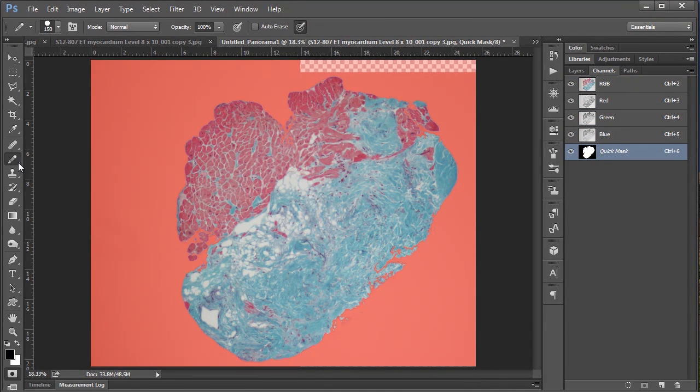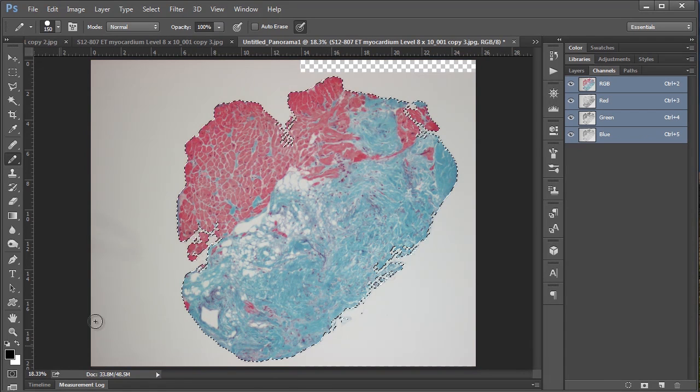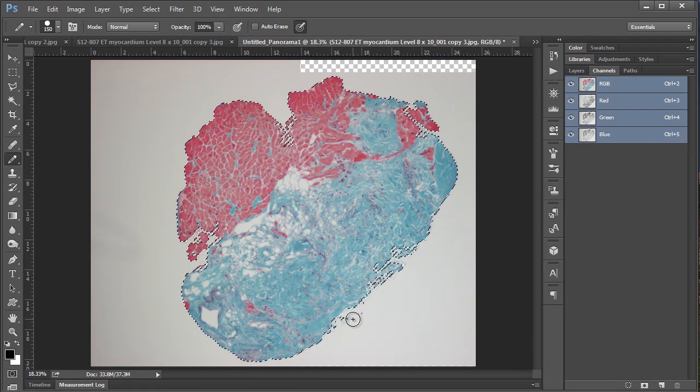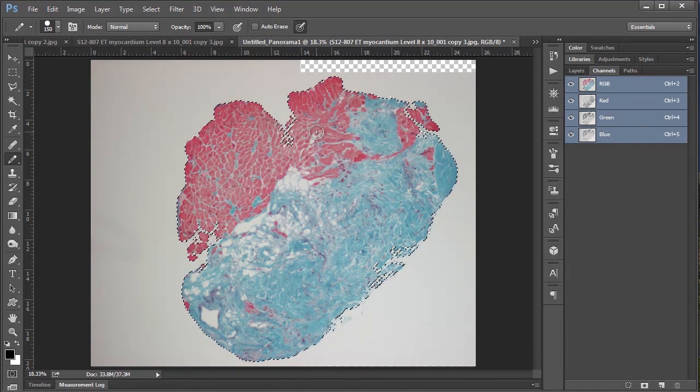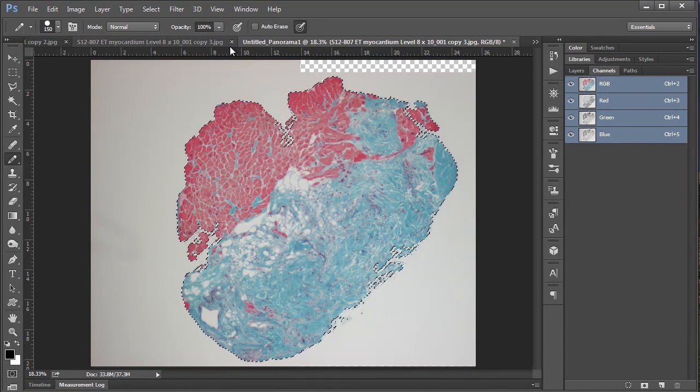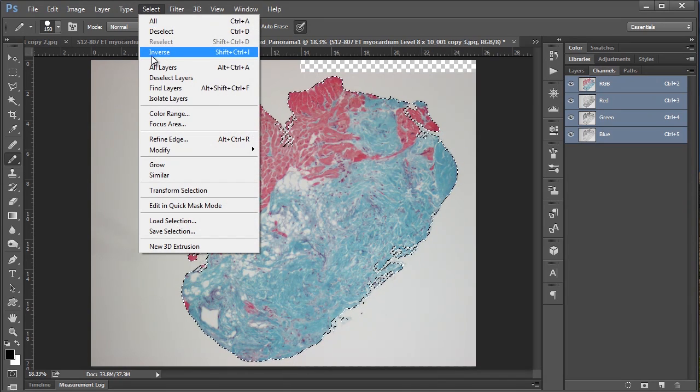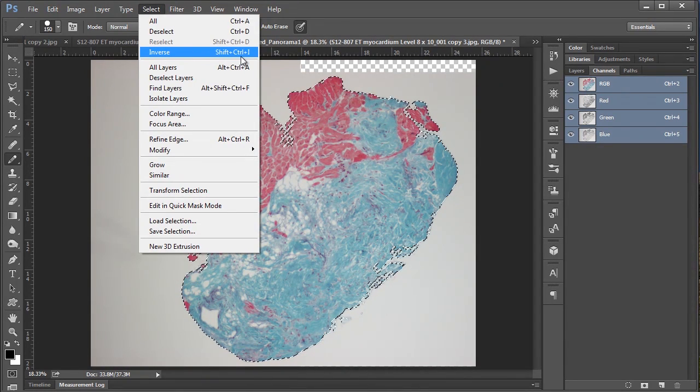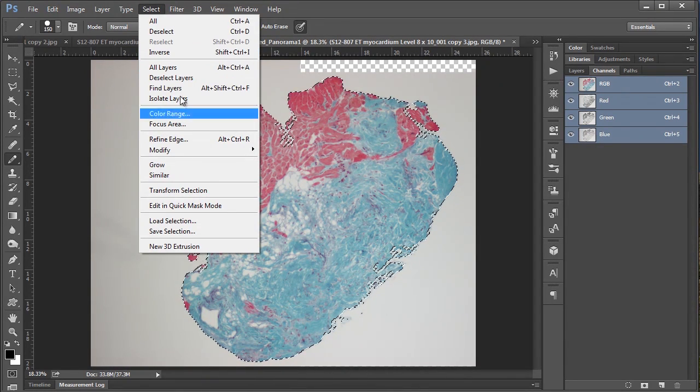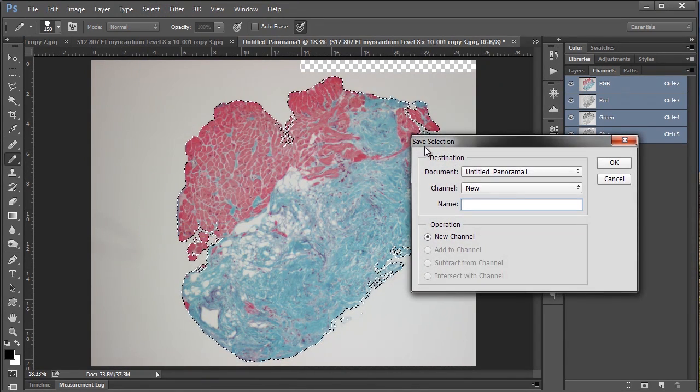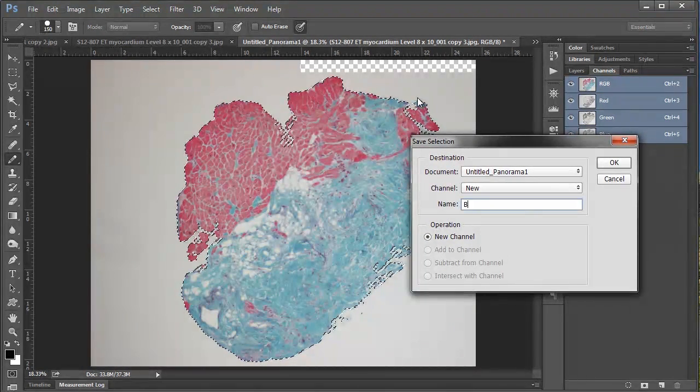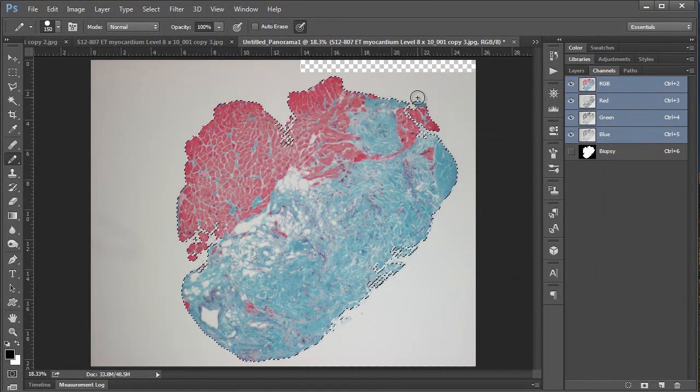So I'm going to go into my quick mask and use my pencil tool and just color that out. So good. So it's gone now. And also I should say for select the menu item is right here instead of the shortcut key. So now I'm going to go save selection and now I'm going to call this biopsy and hit okay.